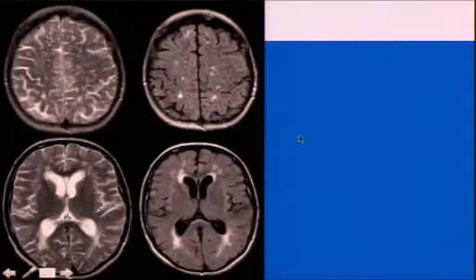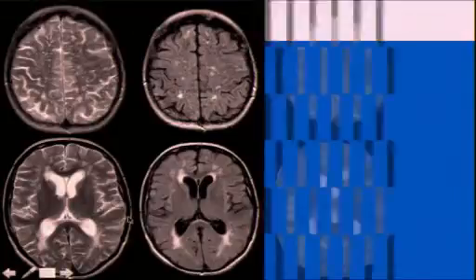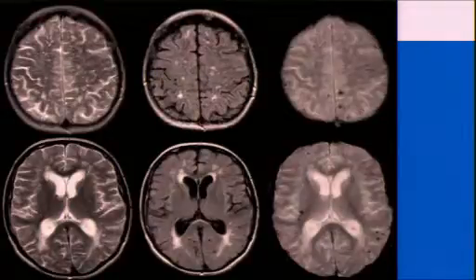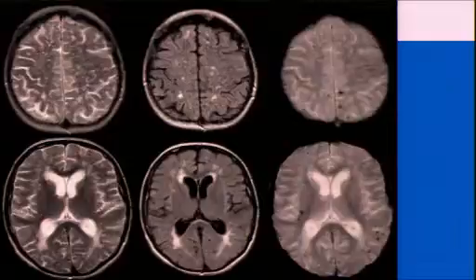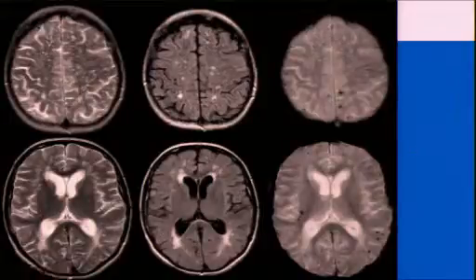What goes parallel to some of those, and I will come back to that later on because it has an impact on the treatment of subjects, is that parallel to the white matter changes, we also find microhemorrhages, especially in early stages of dementia patients. We do see them, and they are often correlated with the underlying disease, like hypertension. With hypertension, we can see microhemorrhages within the tissue. They are more centrally located, like around the basal ganglia and the posterior fossa. But if we do see them in a subcortical location, they are often correlated with a disease which is amyloid angiopathy.